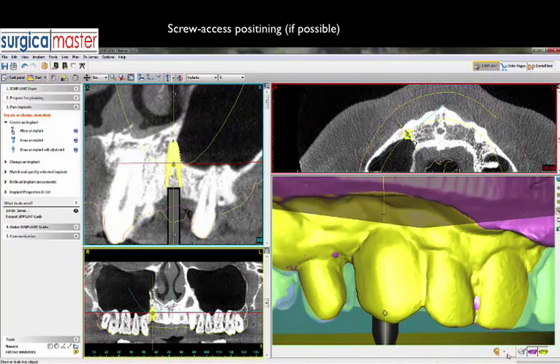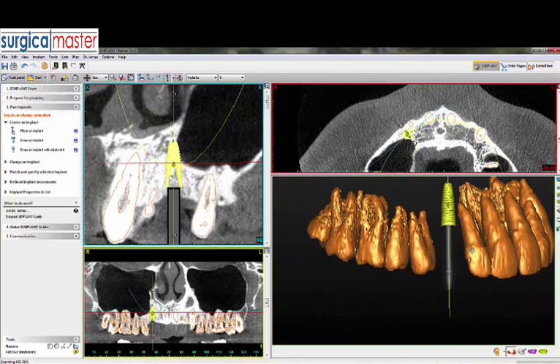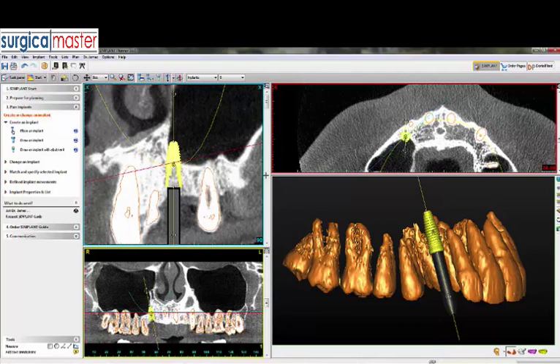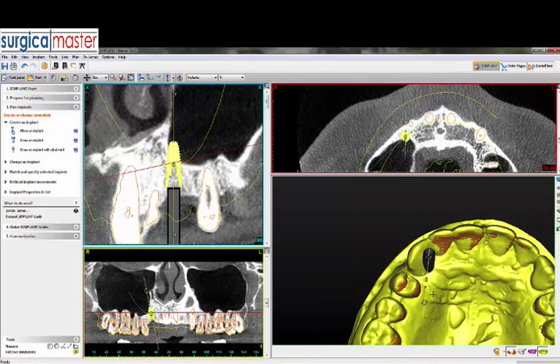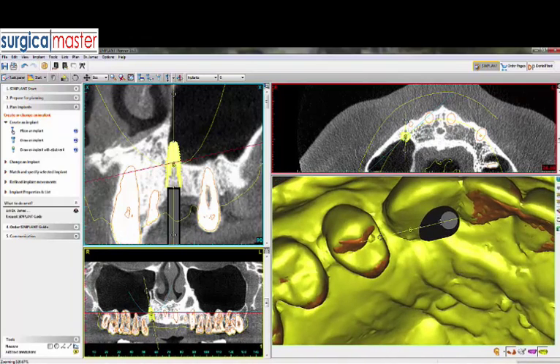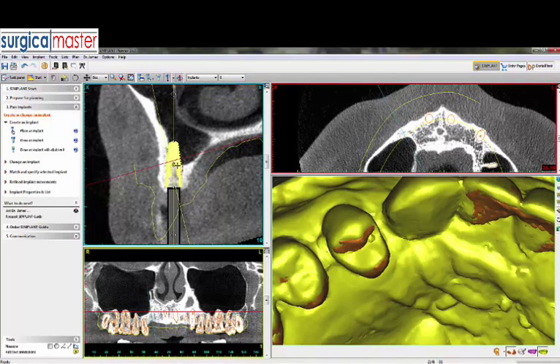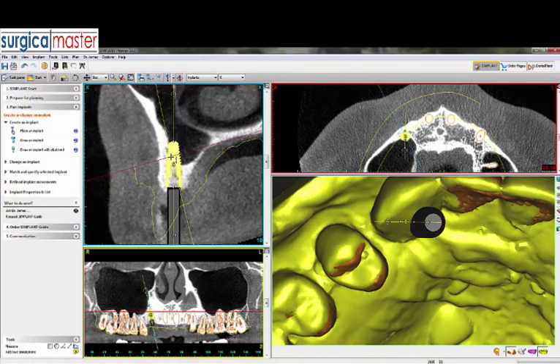Looking at the rendered roots and teeth, I can tell this implant is not parallel with the adjacent lateral incisor, which is very important. I'm going to align it with the lateral and make it more parallel and see what it does to the restorative position. Looking much better now — we're a little too palatal, so I'll move the implant slightly more to the buccal, just bodily. Now we have a relatively good restorative position.